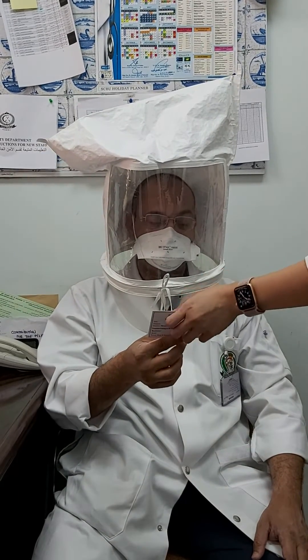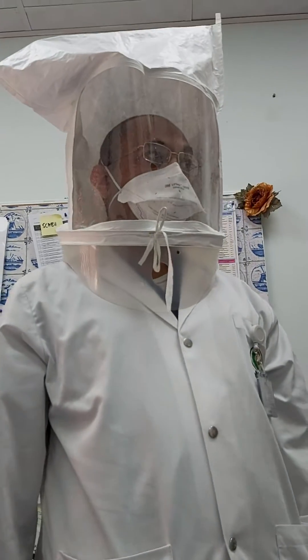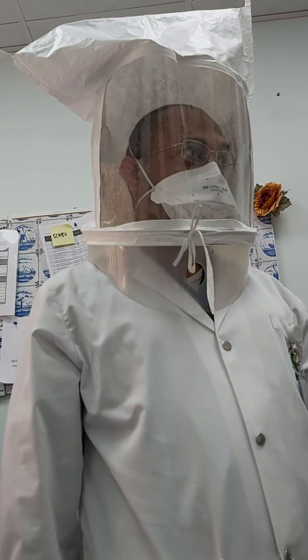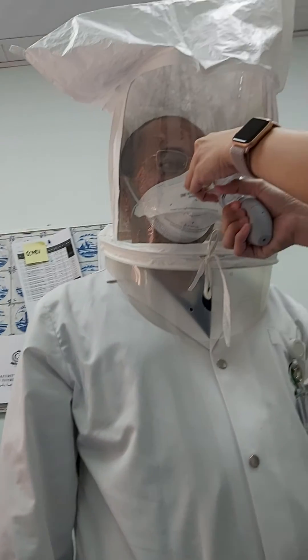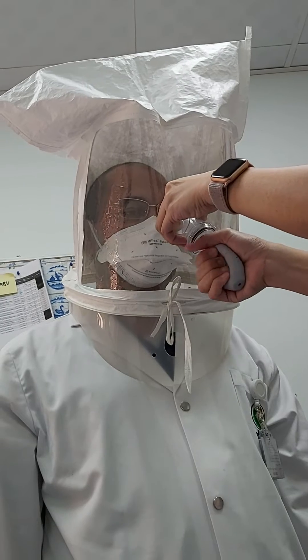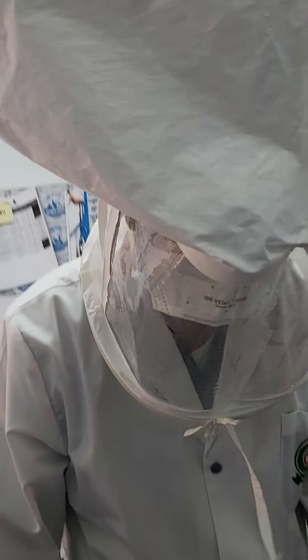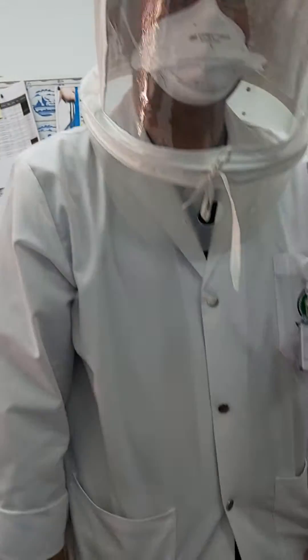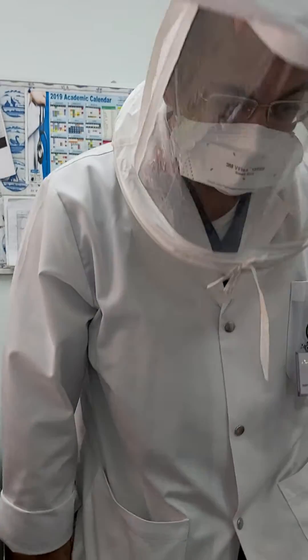Okay, let's go back. You stand, doktor? I will give you two options: you will jog in place or you will bend. What do you like to do? Bend. Okay. Just bend, doktor, like this. 30 seconds. Bend up and down. 30 seconds.